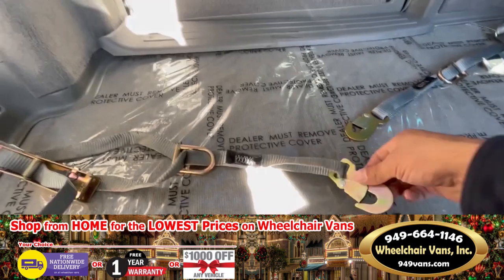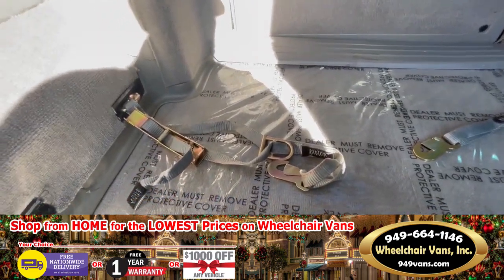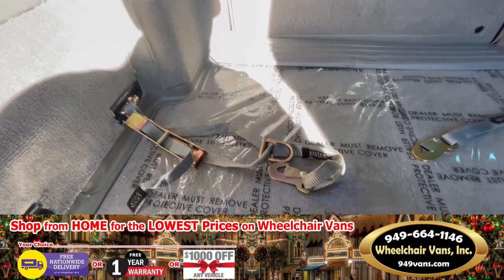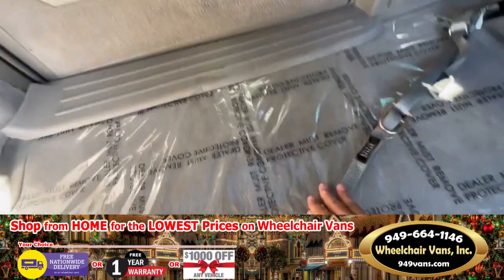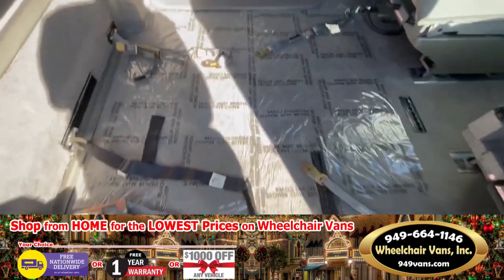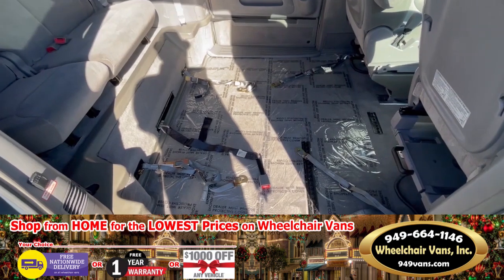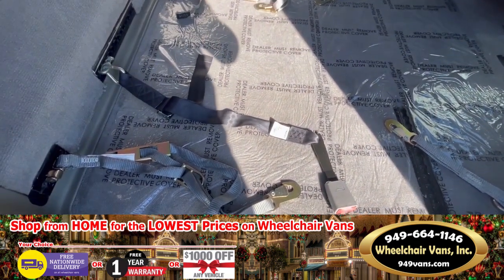To secure the wheelchair, you're simply going to loop this around the main frame of the chair — nowhere else, not the wheels or tires, but the actual main frame of the chair. When you're done, you have a four-point wheelchair securement system: two facing forward, two facing backward, as well as the seat belt system ready to go.